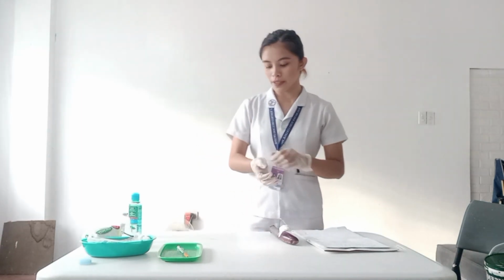So after withdrawal, discard the uncapped needle and the attached syringe into the proper receptacle to prevent accidental injury. So now I can remove my gloves and perform hand hygiene to deter the spread of microorganisms.